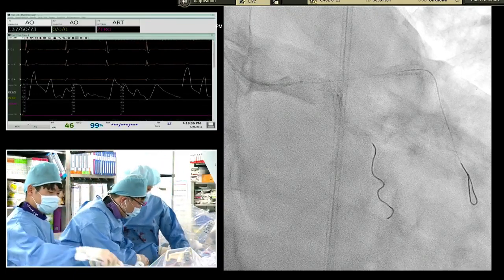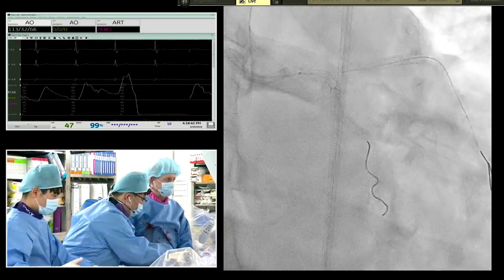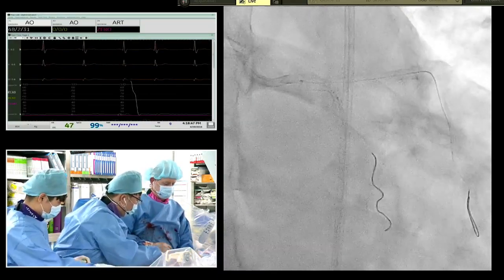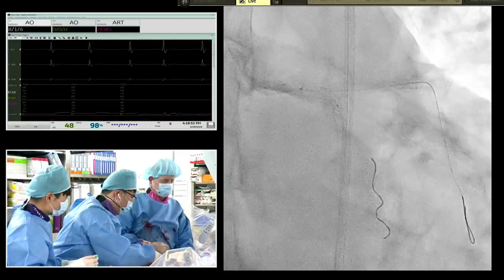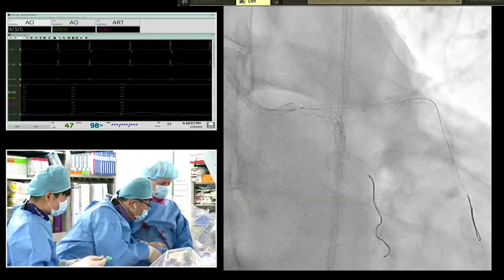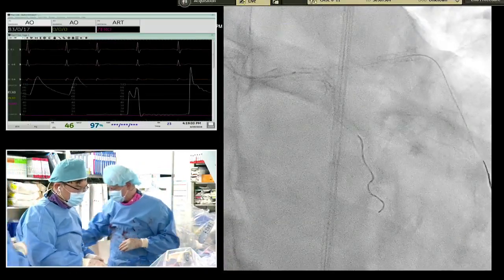Okay, we'll finish the... Which kind of drug-coated balloon is it? Paclitaxel coated balloon. You don't have the sirolimus one in Korea? No, we only have the paclitaxel balloon. In Europe, we even have a drug-eluting scoring balloon with sirolimus.